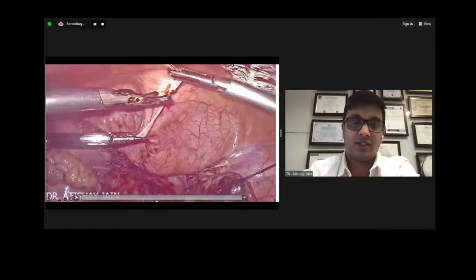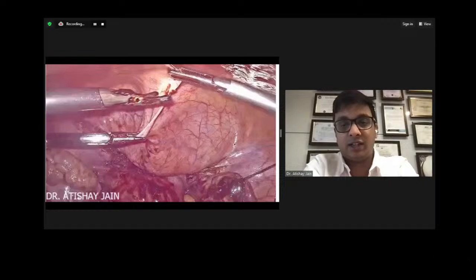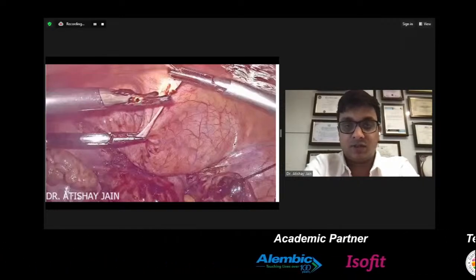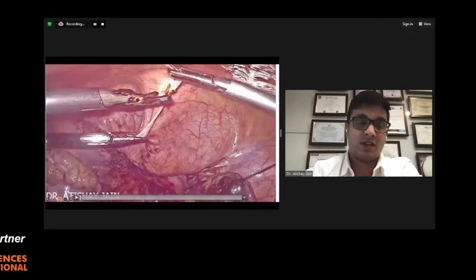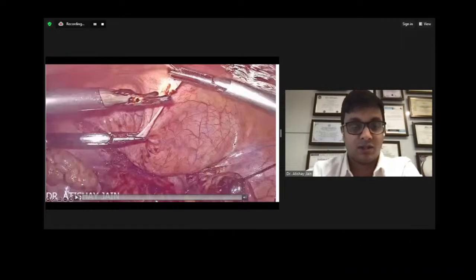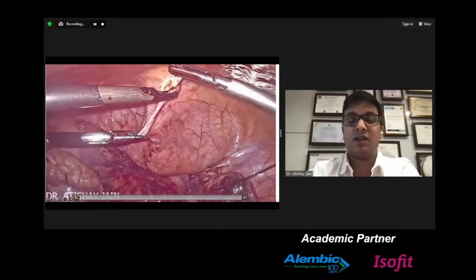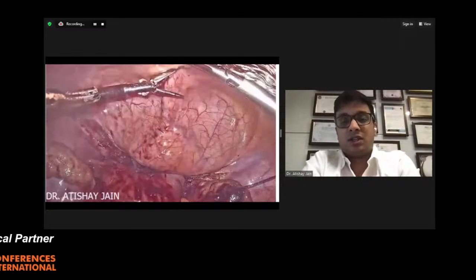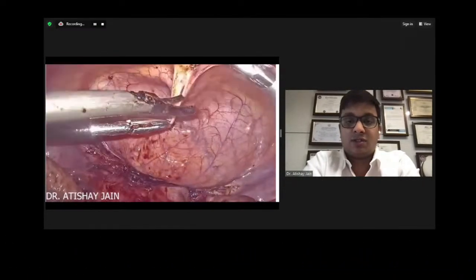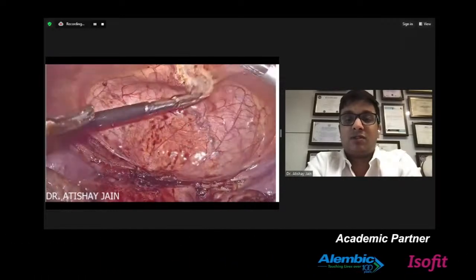Retzius. So this was an interesting case. This was diagnosed as a case of subserosal fibroid on the anterior part of the uterus and near the cervix. It was diagnosed on the MRI somewhere outside, and this patient came for a myomectomy. But it ended up being a case of bladder endometriosis, and it was a bladder nodule, which I'll be showing you. When you're going for the dissection of the space of Retzius, you should always fill up the bladder, see the boundaries of the bladder, and just cut above it.